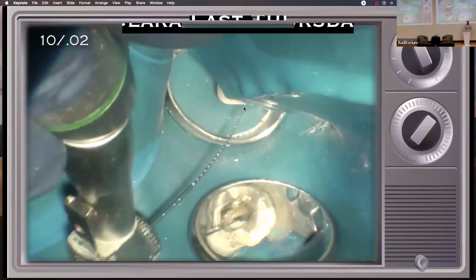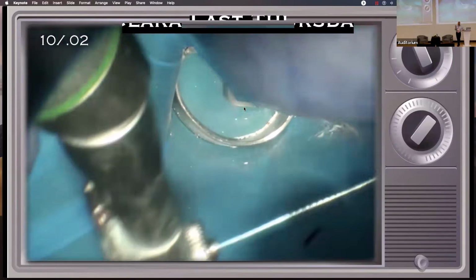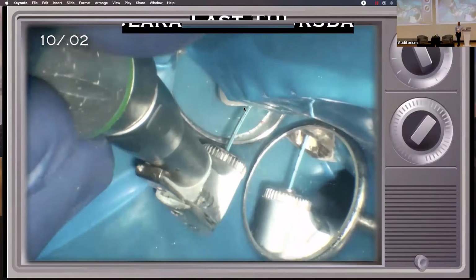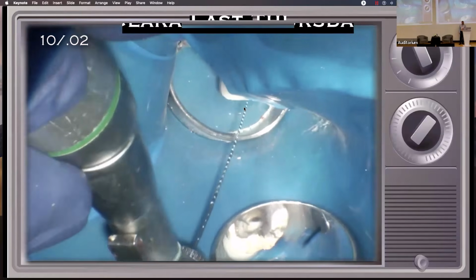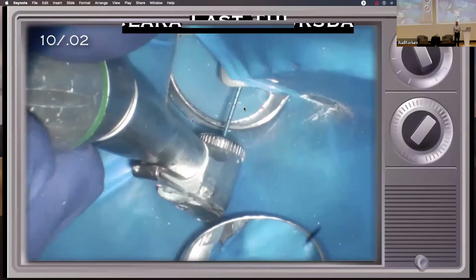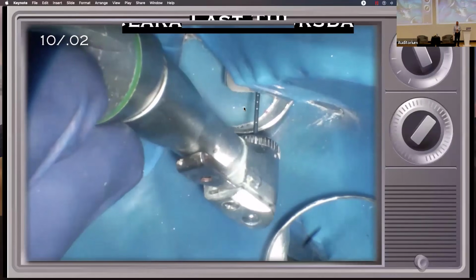Palatal 18.5. There's a palatal. You can see me bung it up a little bit. And the tactile feedback with these instruments, because the tips are so small. 1002. Palatal 18.5. This is a 1002, full tone. Good. And you'll see me with the mirror, I'll do what's called a placement bend on it. So hook it in the canals. See the mirror? Put a little placement bend on it and into the distal buccal.